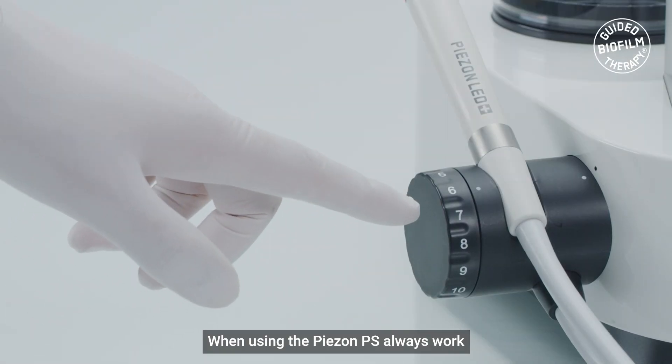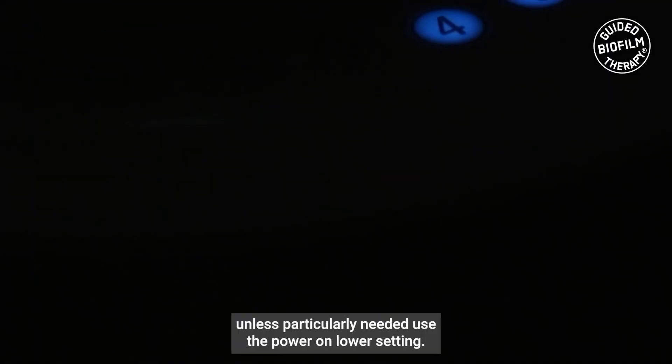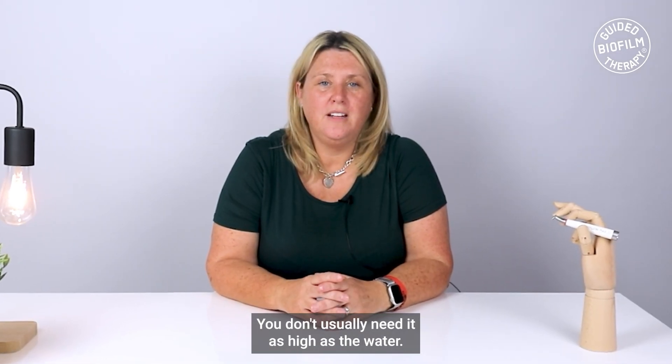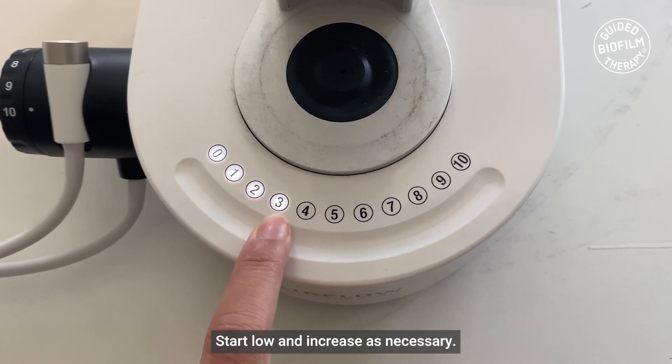When using the Piazon PS, always work with the water between 70 and 100%. Unless particularly needed, use the power on a lower setting. You don't usually need it as high as the water — start low and increase as necessary.